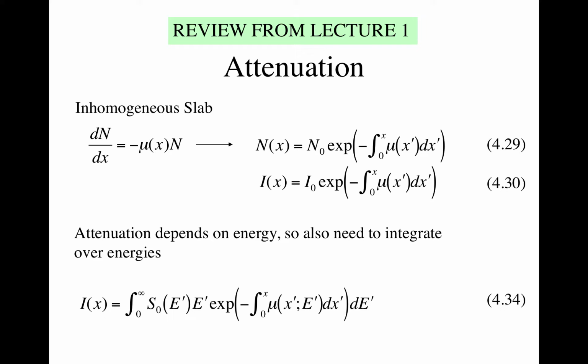And it's very hard to measure, it turns out, the energy spectrum of an X-ray tube in your scanner. You would think that would be something that's easy, right? But it turns out it's not that easy. And it changes, depending on your mA and things like that. So to completely map out that energy spectrum turns out to be a bit of an ordeal.